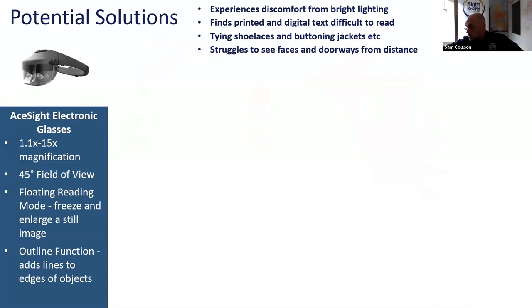Now, if I just change camera for a second. These glasses, as you can see, are a wearable device. So you would wear this as a headset, essentially. And you can magnify up to 15 times using these glasses. So they're very good for seeing at long distance.